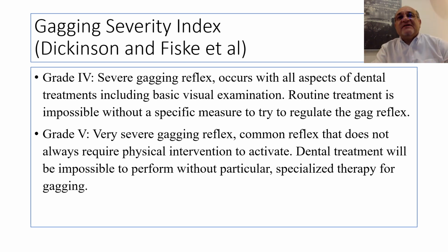Actually, our patients range between grade 1 and 2 in most cases. As the grades of difficulty increase, more measures should be taken to control the gag reflex.